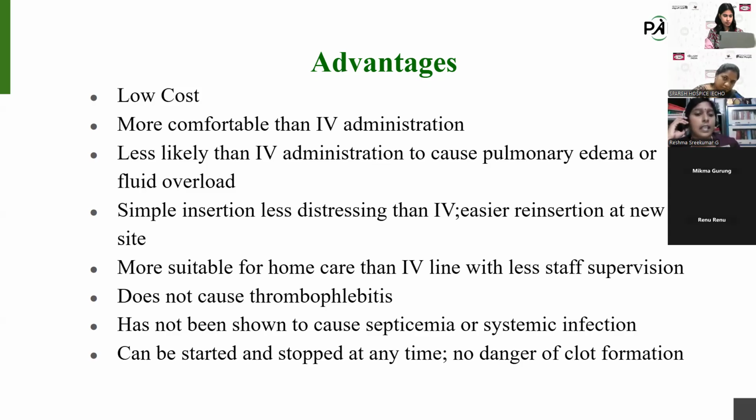And it is less likely than IV administration to cause pulmonary edema or fluid overload. I already said we can only give a maximum of 3 liter in 24 hours in 2 sites. So the chance of pulmonary edema or fluid overload is less compared to intravenous administration. So it is very safe to use. Then, simple insertion, less distressing than IV, and easy reinsertion at new sites.